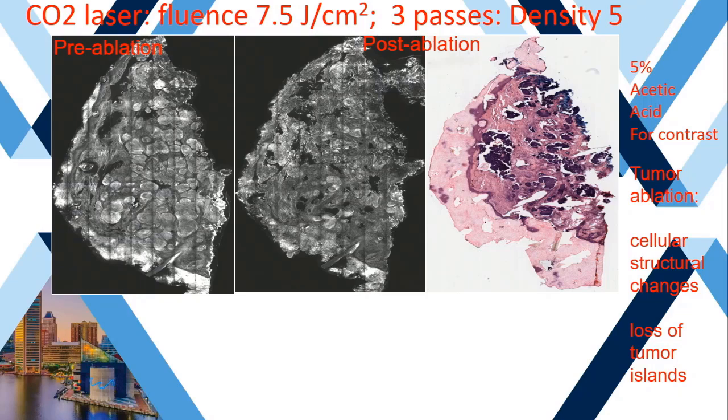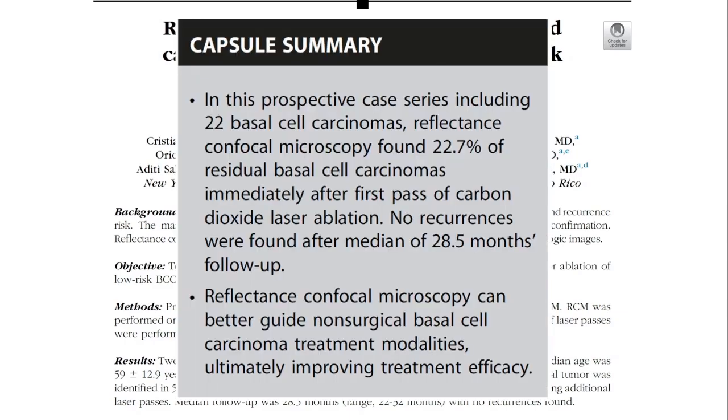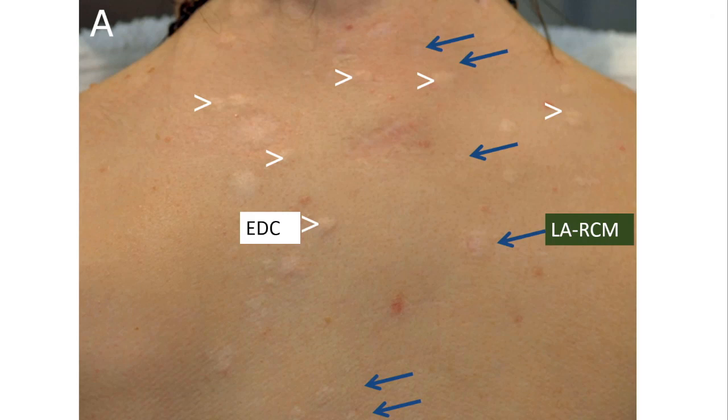So using a CO2 laser to ablate early skin cancers without cutting. And we published this as well. So another non-surgical method to destroy early skin cancers. Because, again, people who have multiple skin cancers are tired of getting cut or ED and C, and these scarring patterns can be quite poor, right?